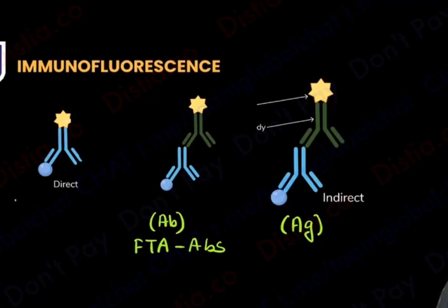Direct and indirect. Okay? Now I teach it a little different in comparison to how others have taught it, because this one slide will give you everything. It seems the same, ma'am. It's looking like antigen, antibody. In the end, you have added some light signal because it's fluorescence, everything is looking the same. Like I said, direct fluorescent testing is basically for testing the antigen.